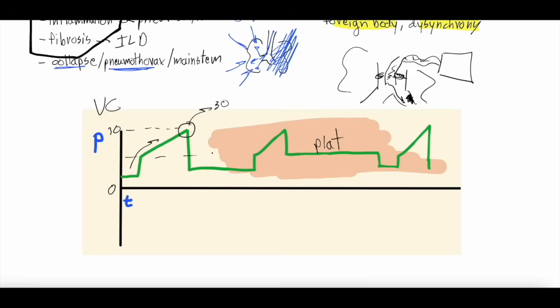So that is literally on the scalar will give you a pressure. You know, if this is 30, let's say maybe this is just 20. Nice normal plateau pressure. And it will kick this out on the screen too. There will be a little area that says plat, and then it'll give you a number like 20. But you have to do the inspiratory hold, right? You have to hit the button, and our respiratory therapist will do this. Certainly shouldn't be doing it too much on the ventilator without the respiratory therapist, especially if you're early on in your training. But you have to do an inspiratory hold to get the plateau pressure, whereas the peak pressure is just that peak pressure at the end of each breath, and that's an automatic thing the ventilator reads.